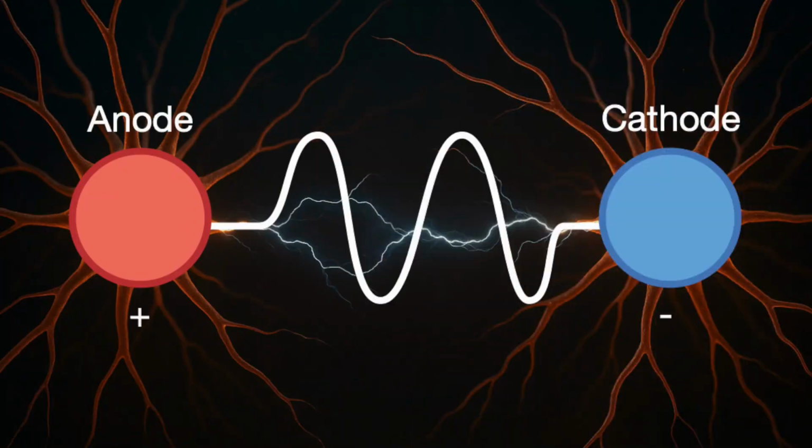What happens in our brain is nothing other than current flowing from the negative to the positive pole and then back again, alternating current. What we record is simply flowing current. And we call the whole thing an electroencephalogram, where the word cephalo stands for brain, and electrogram means we're recording electricity. Let's take a quick look at the image here.